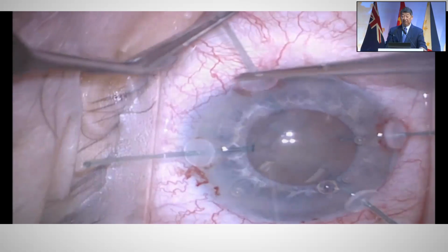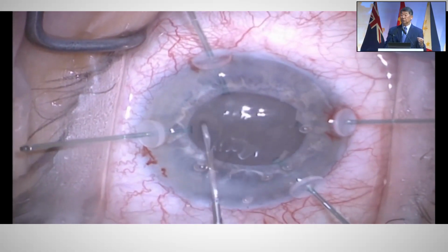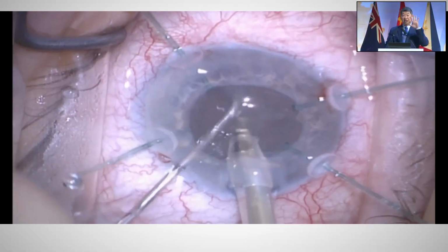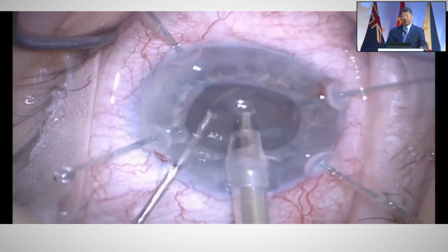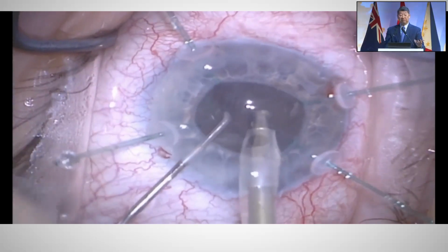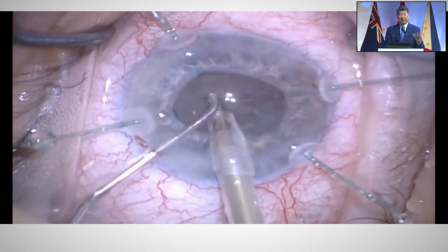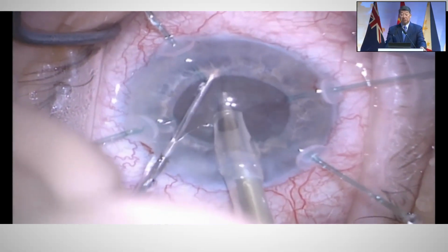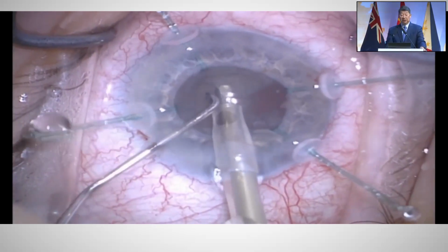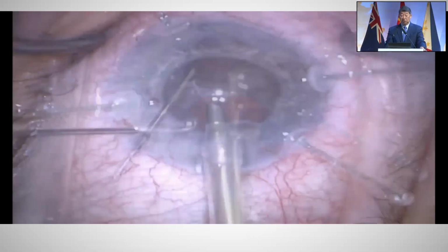It's the Chang version. I have no financial interest. And be careful not to tighten them. This is not like iris retractors where you want to put this on stretch. Remember that with the infusion, everything moves back a little bit, so sometimes these can be too tight. But you can see how this also keeps the peripheral capsular bag from being aspirated into the phaco tip. It restrains that, and it supports it in the AP direction while giving that counterfixation, letting me rotate the nucleus. So you want to delay putting in a CTR and use these to fixate the bag during the phaco.